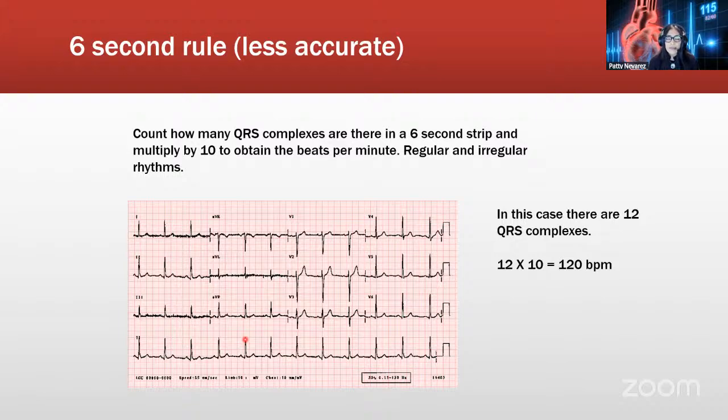Again, in the cath lab, this is not as important or that we need to be that specific, but it's a good method to know your information. And you have your table, the large box table, in your modules, because that's going to be on your RCIS. So you need to know that table by memory. Okay, and that's all I have for today.